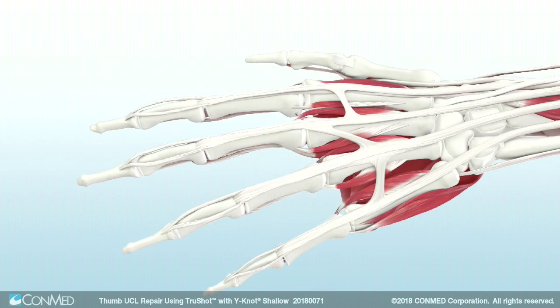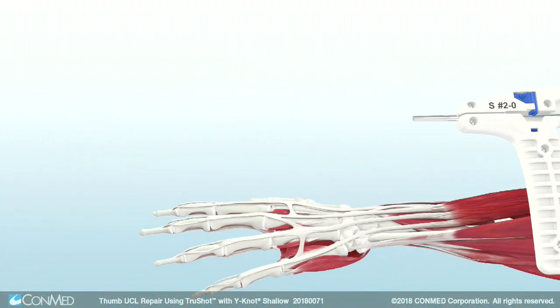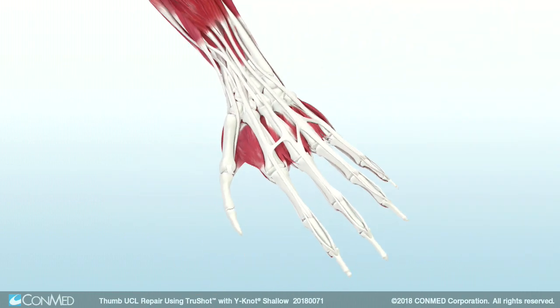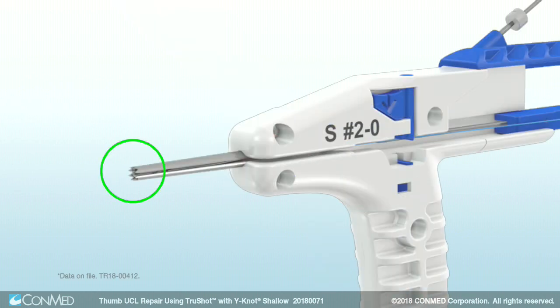To begin, make a longitudinal incision across the ulnar side of the MCP joint. Position the distal tip of TruShot's drill guide against the cortex of the proximal phalanx. The tip features a crown texture to ensure secure placement of the device during pilot hole drilling and anchor insertion.